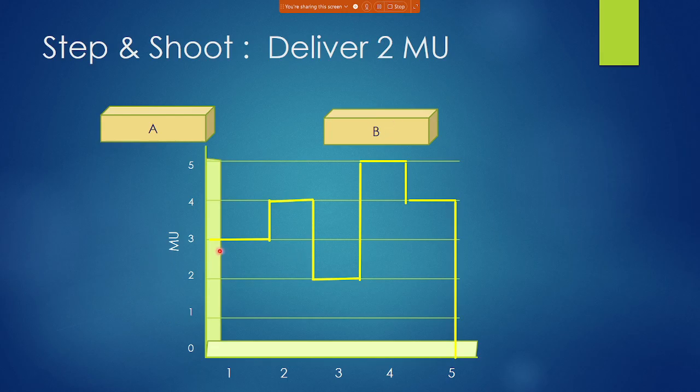Now here I have to give actually 3 mu, I'm sorry, and here I have to give 2. Suppose I keep it fully open and give 3, here it will become 3. But here I should not get 3, I get only 2 here. So what I will do is close the rest and bring my MLC leaf to this point and deliver 2. I can take the leaf up to here and deliver from here to here. Or I can even just open it completely and deliver 2 over the complete width. So we have to decide how the segments are done.